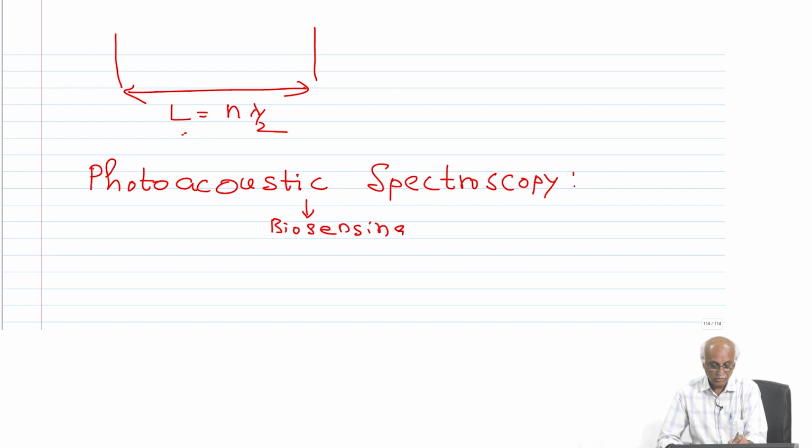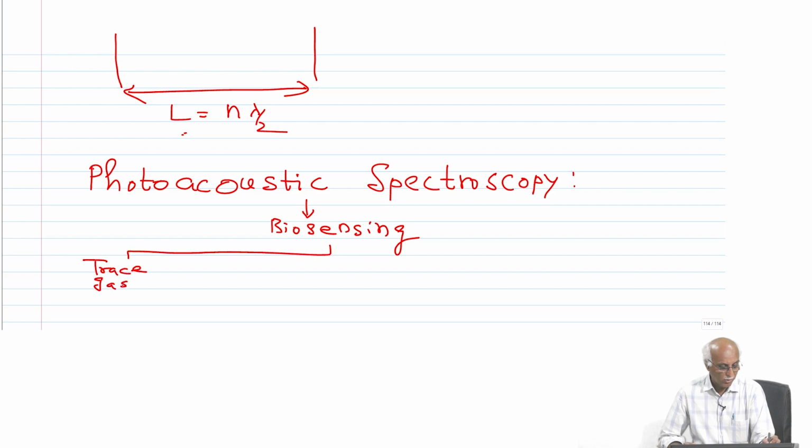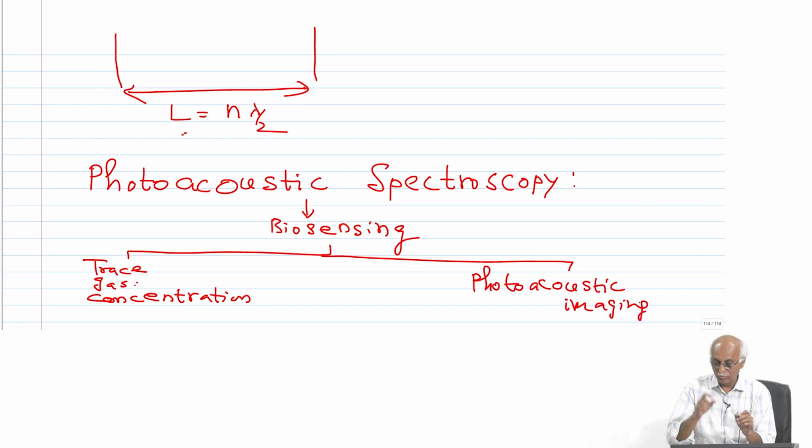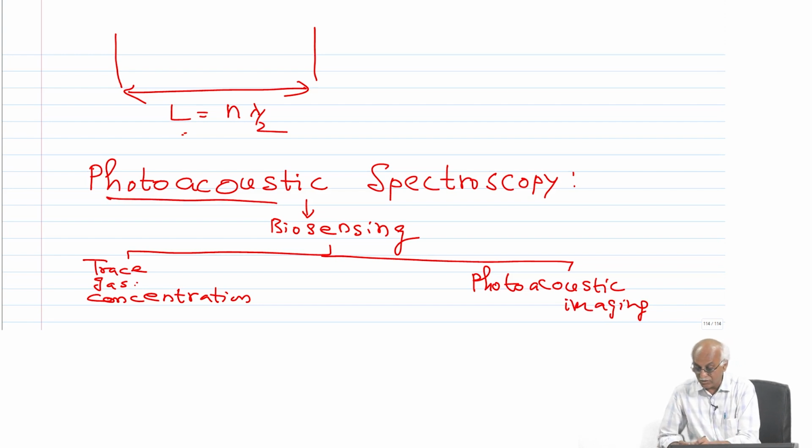It has emerged as a very good non-invasive approach for measuring trace gas concentration, as well as photoacoustic imaging is possible using such a technique.